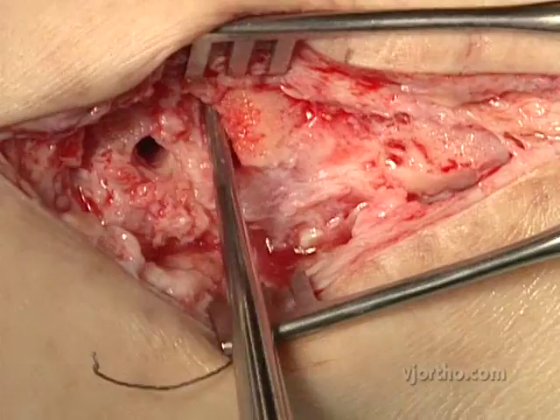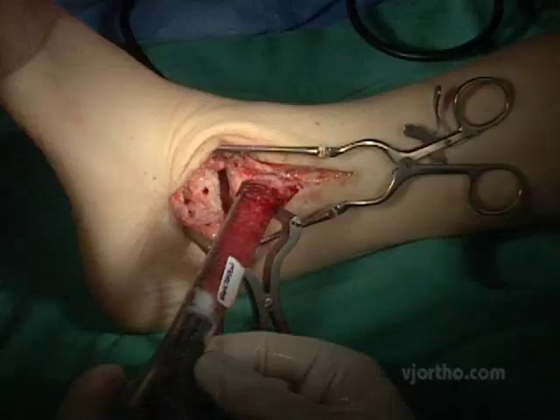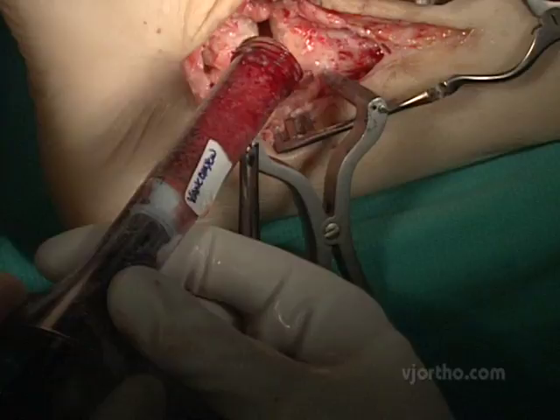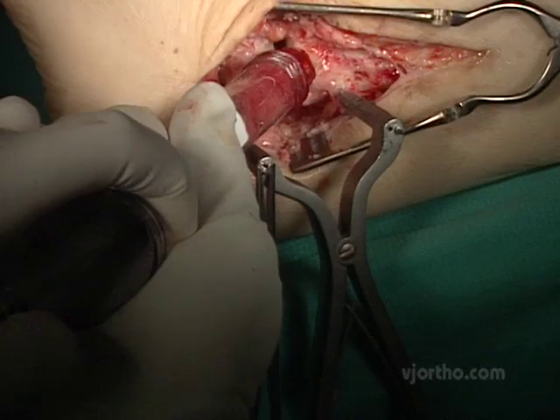I'm going to prepare this enough that I can feel confident I can optimize his chance for union. This is allograft chips mixed with his own blood that's been spun down to a platelet-rich product. I put a small amount of vancomycin powder — you can certainly argue that it probably washes away in the first few seconds, but it may help fight any infection or bacterial contamination that may occur intraoperatively.